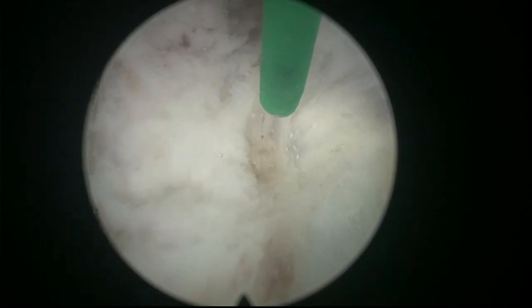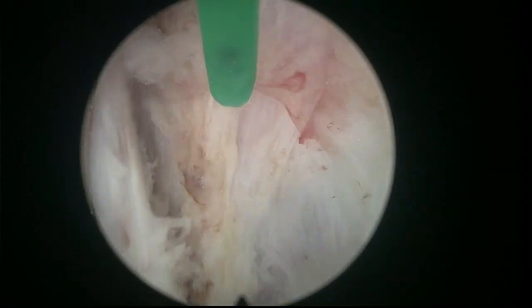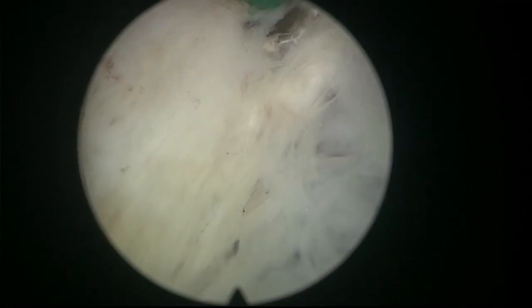Of course, here you see the fiber needs to keep really close to the adenoma so we don't insist on the capsule. There we are, huh? Close to the adenoma so we don't go into the capsule.